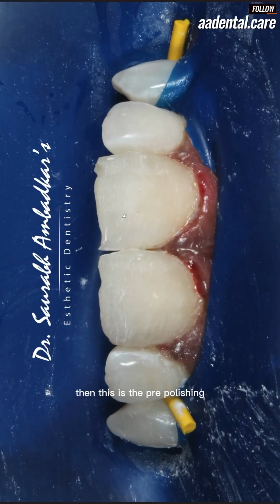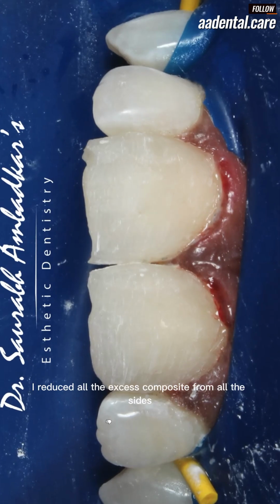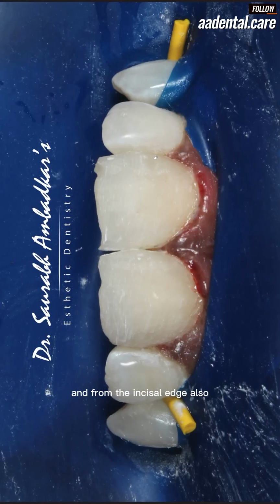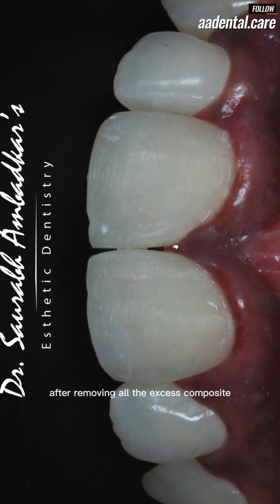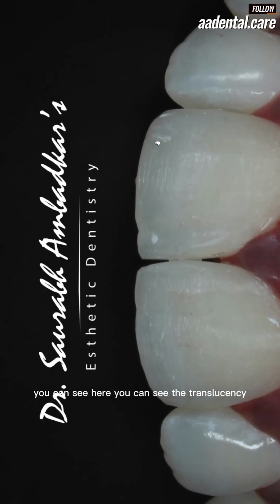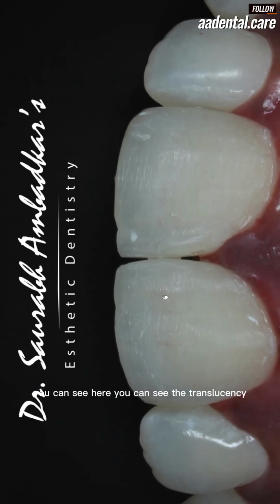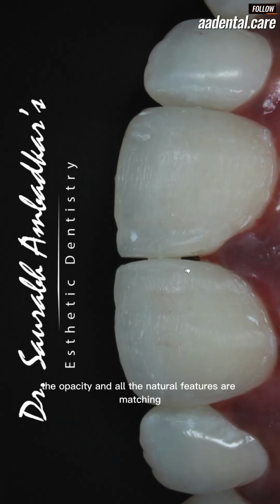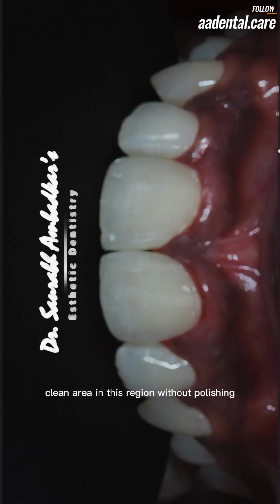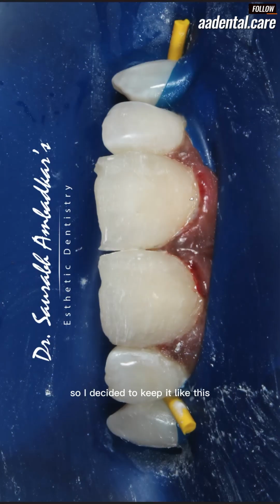Then this is the pre-polishing, that means finishing. I reduced all the excess composite from all the sides, from the proximal sides also and from the incisal edge also. After removing all the excess composite, this was the tooth. Now they are well in shape. You can see the translucency also, the opacity and all the natural features are matching. This area is very critical. You have to always maintain a self-cleansing area in this region. So I decided to keep it like this for another 24 hours. In this case, I did the finishing and polishing after 24 hours.